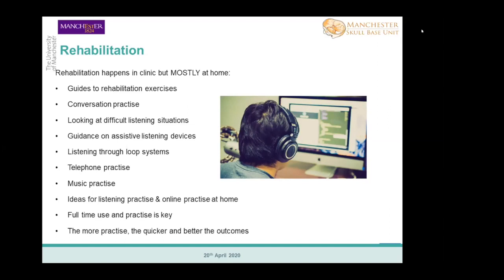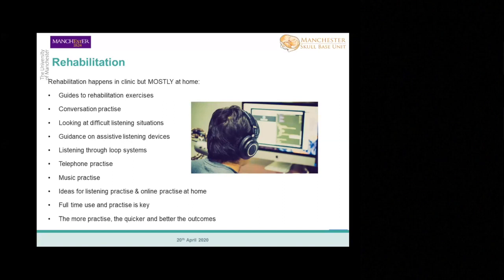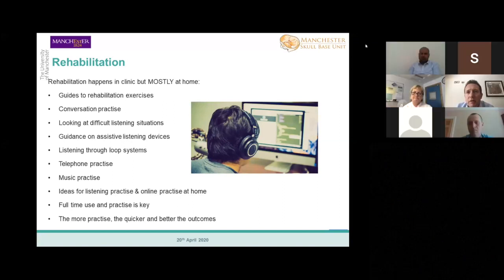Great, thank you very much. Just a couple of questions. We've had one from Laura saying, would you consider cochlear implantation in unilateral profound deafness in a paediatric patient? I don't know, Deborah, do you want to answer that one?